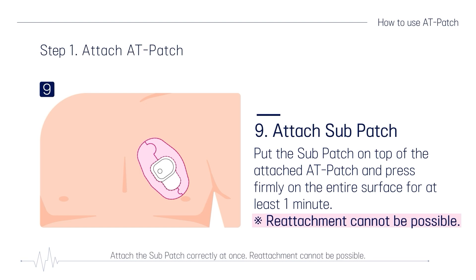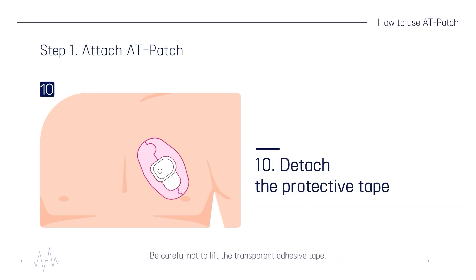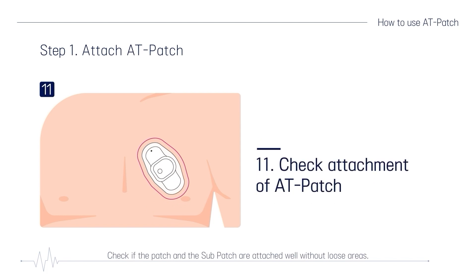Attach the subpatch correctly at once — reattachment is not possible. Be careful not to lift the transparent adhesive tape. Carefully peel the white protective tape off from the base film. Check if the patch and the subpatch are attached well without loose areas. If there are unattached areas on the skin, press the base film with your finger smoothly to ensure it is attached well.